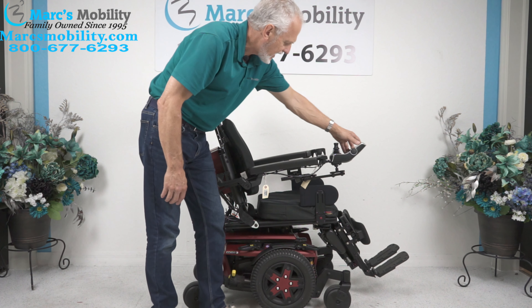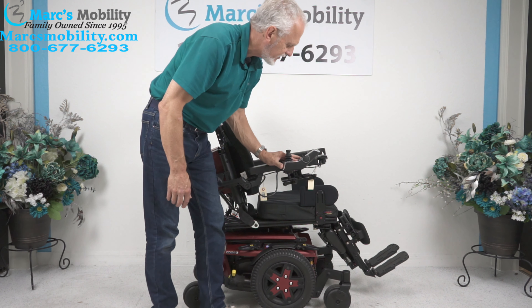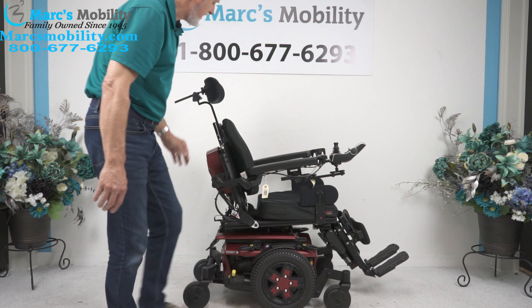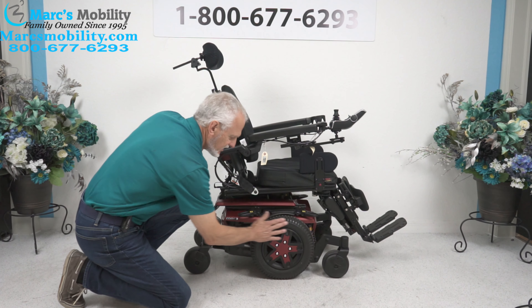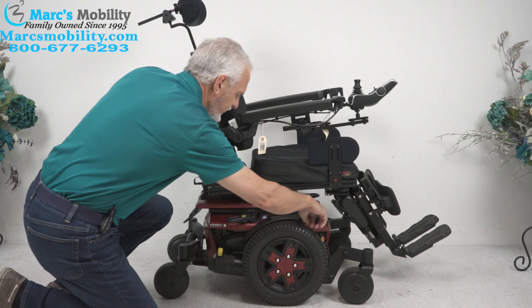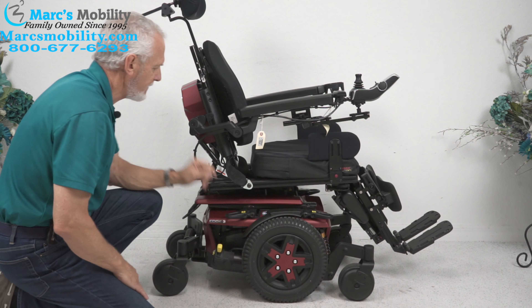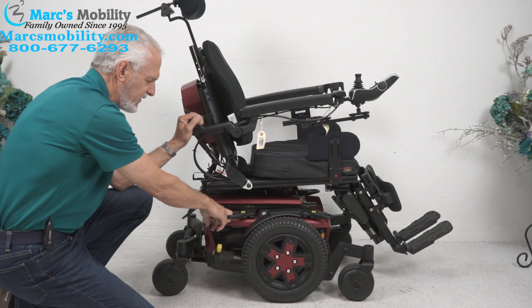This chair also has a swing-away joystick, which takes the joystick away from the front and gives all that extra room to get to a dining table. There are flip-up arms, and you have a cup holder on that side. Down here are your regular 14-inch solid tires with matching colors for the frame. You have solid anchor points here and here — this is where you would secure your chair to your lift or van for transport. There are two on each side.